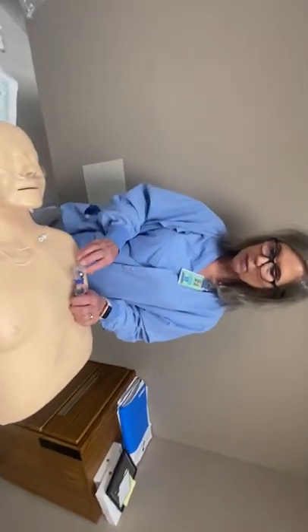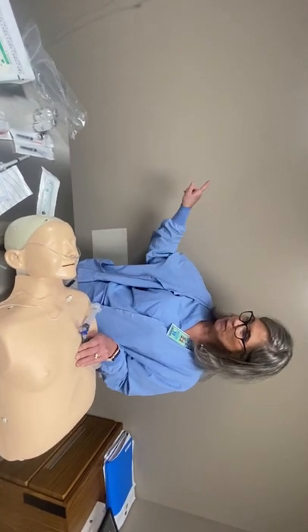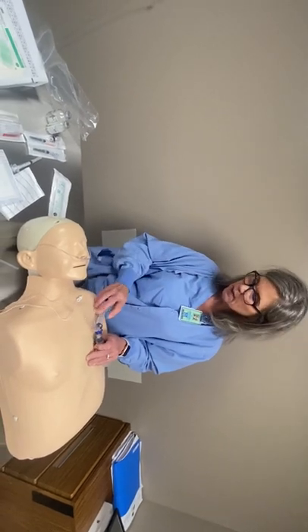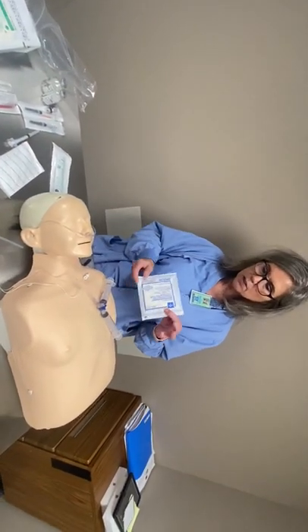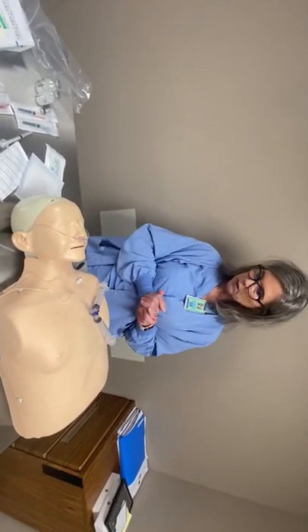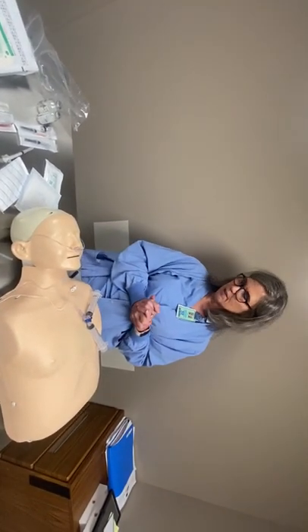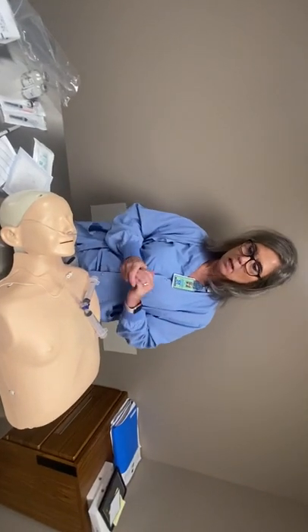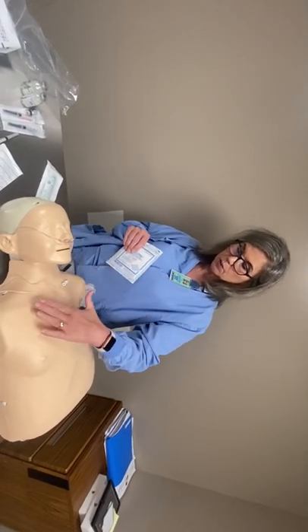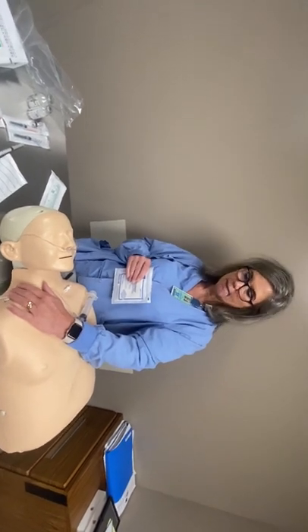Once that's all done, if the anesthesiologist hasn't already told you to take a picture during the procedure, before they remove the needle make sure you get an image on the ultrasound. Get your image, they'll pull out the needle, and you're done. Either the anesthesiologist or yourself will wipe off the site. Make sure all needles are disposed of in the sharps container — some doctors are not always careful about that, so keep an eye on it. Apply a band-aid if needed; typically they don't bleed, but if there's a little oozing, use the sterile gauze and apply light pressure until it stops.